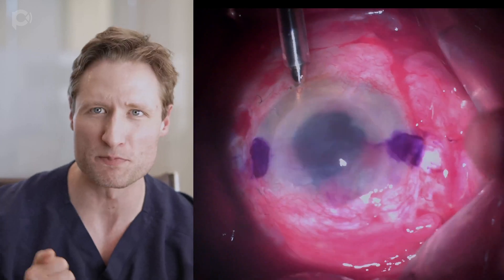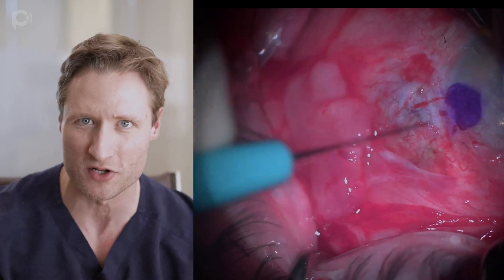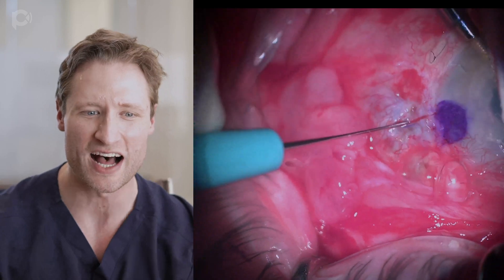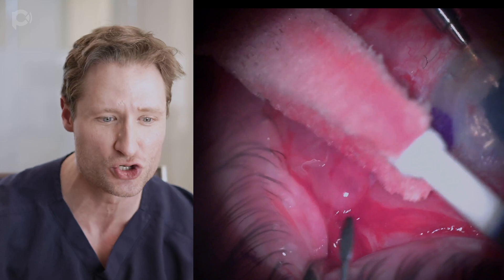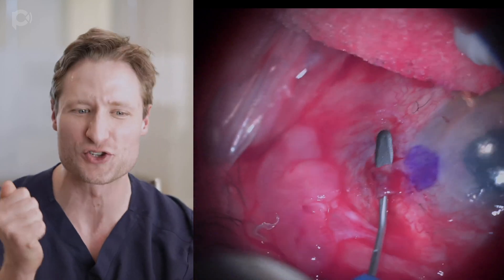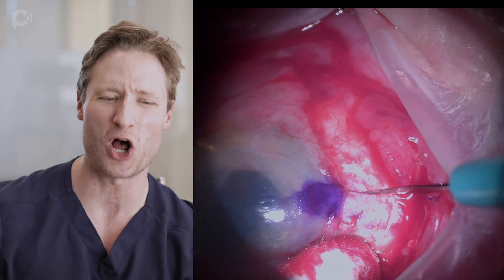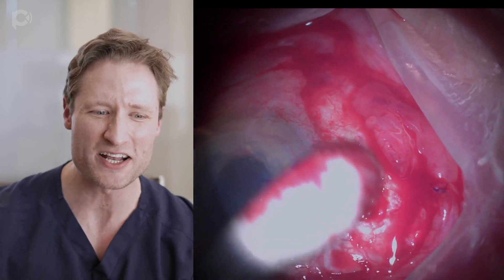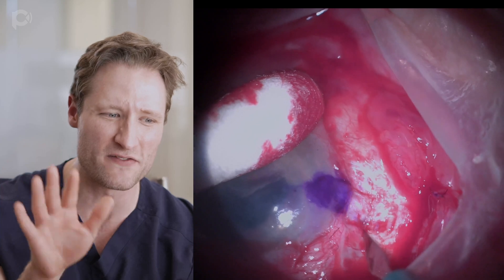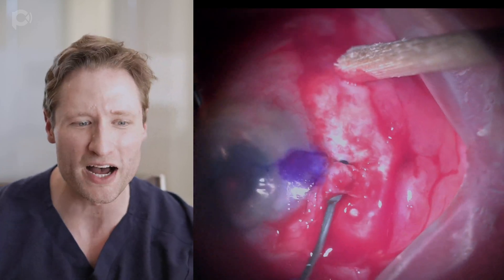The next step is to put a new lens inside the eye. I like to use the glued IOL technique for that preferentially. I'm dissecting these partial-thickness scleral flaps, which is more difficult than it should be because the eye is soft. I've had to make all of these incisions, and the eye is soft and floppy because of all of these wounds, which is why it's caving in and indenting — making these flaps much more difficult.